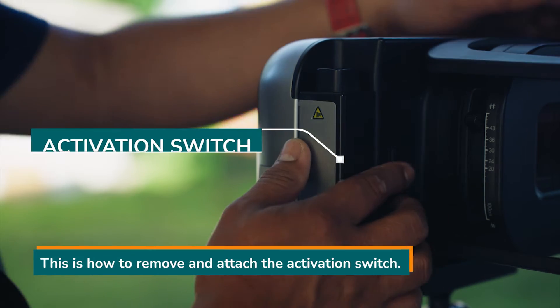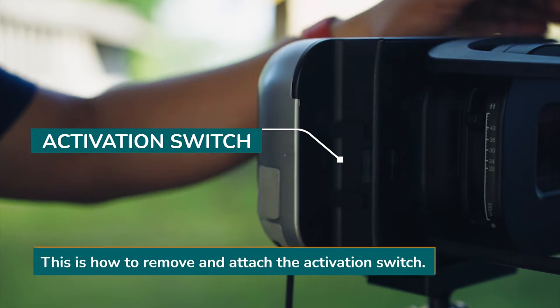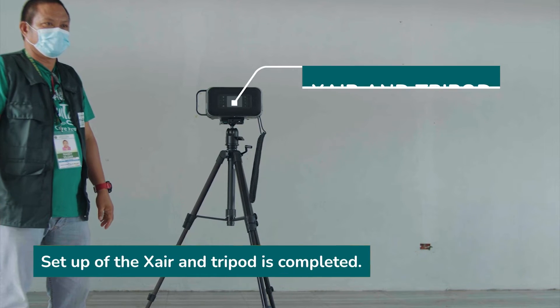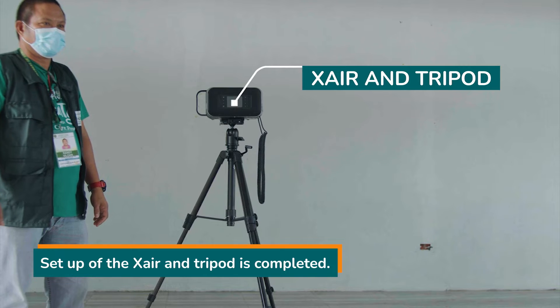This is how to remove and attach the activation switch. Setup of the X-ray and tripod is completed.